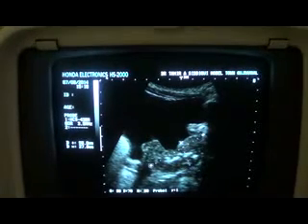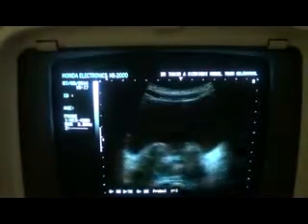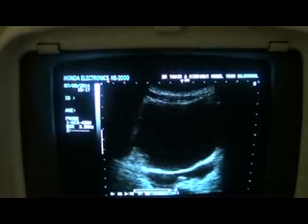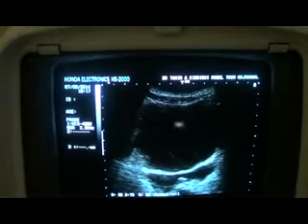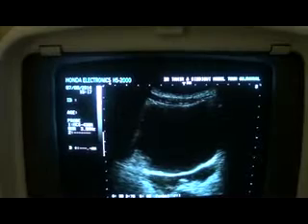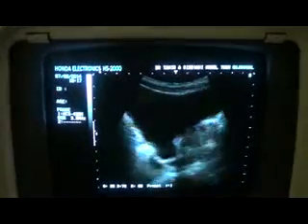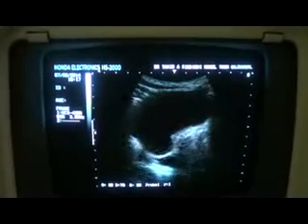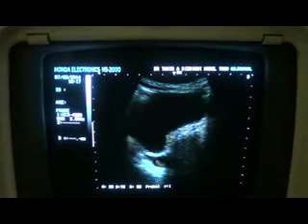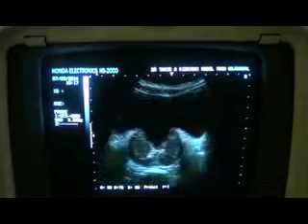Rest all this area is the growth mass relating to the prostate, measuring approximately 5.6 into 2.7 centimeters. There is no calcification seen in the urinary bladder, and the internal of the urinary bladder is normal. This is the ascitic fluid seen in transverse section posterior to the urinary bladder, and this is the fluid that you will see in longitudinal section. This black triangular area is the fluid adjacent to the prostatic fossa.